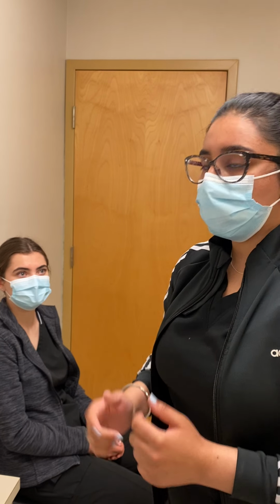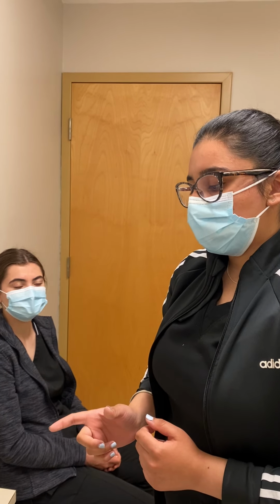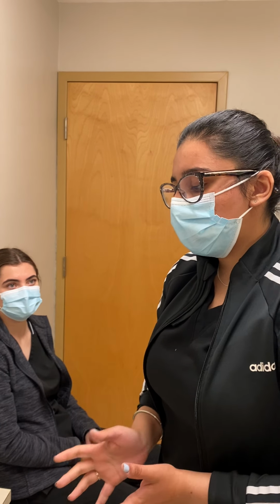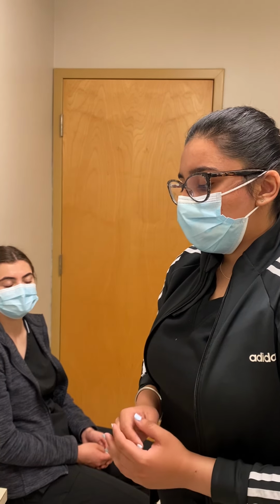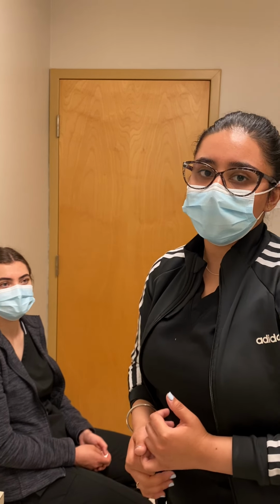Get another staff member to come in, open the eyes wide, and then you do the measurements. So just make sure, again, you're very gentle with this. It just sounds and looks more scary than it is for the patient as well as the staff member. So again, the key is to just be gentle and make sure that the patient isn't very uncomfortable.